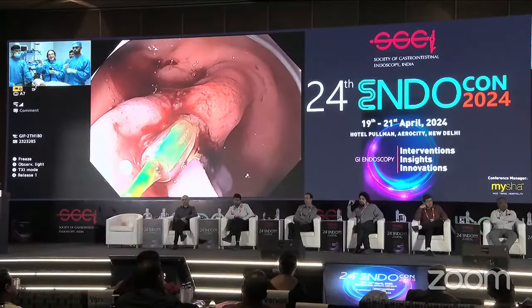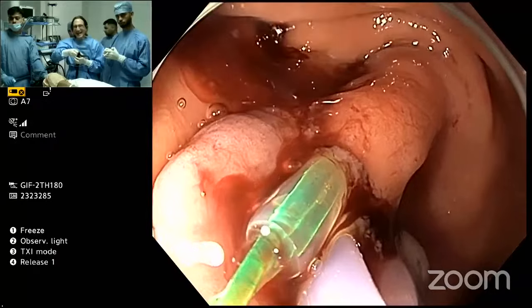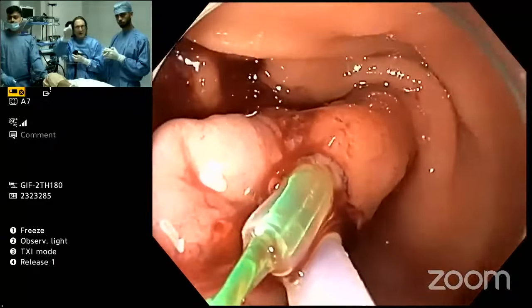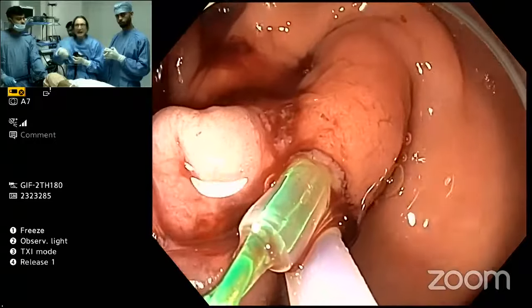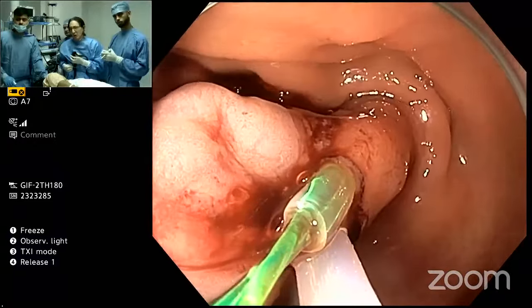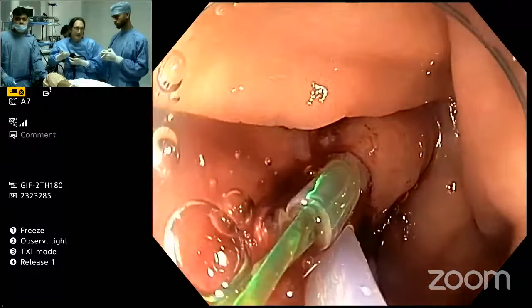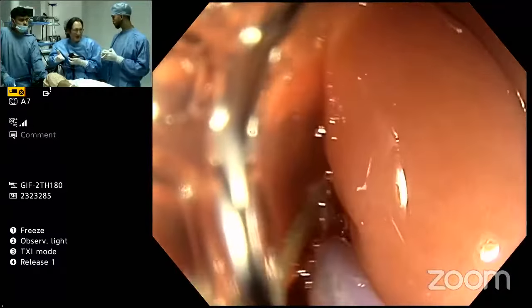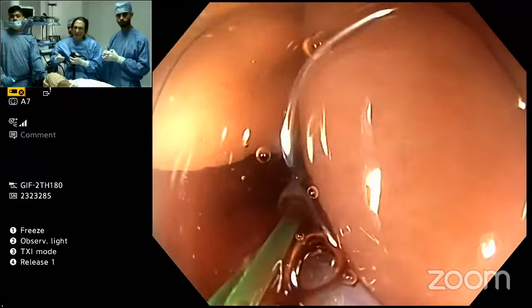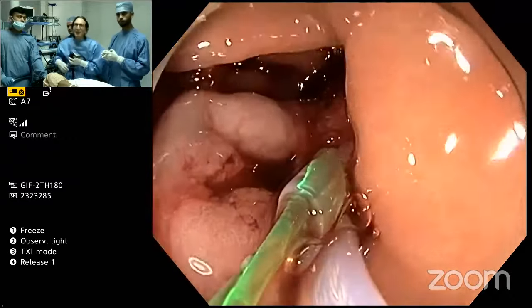But that's the reason for traction, which you could do with a single channel if that anchor had worked. So I'm above the loop now. You see the loop is very tight. And the engineers also designed this loop to give a better hold. It's called the slip knot. Olympus calls it the slip knot. They didn't know that by calling it the slip knot, they were telling the truth. It slips. We don't want it to slip. So mine is called the non-slip knot, because I don't want it slipping.